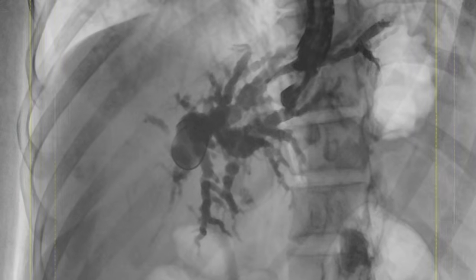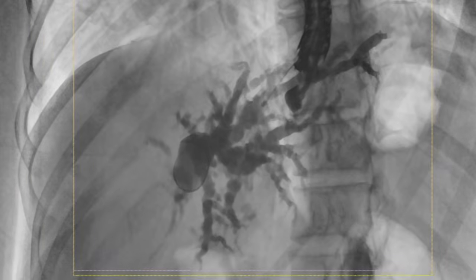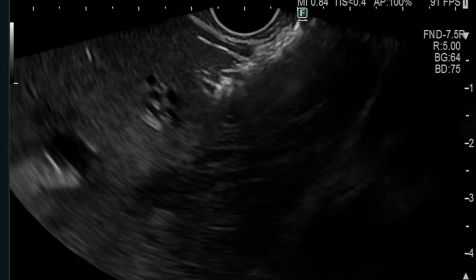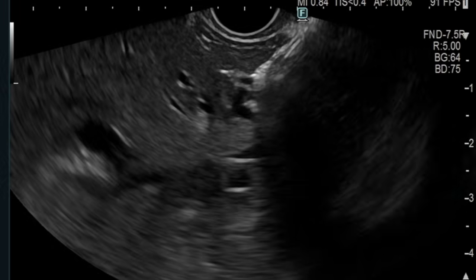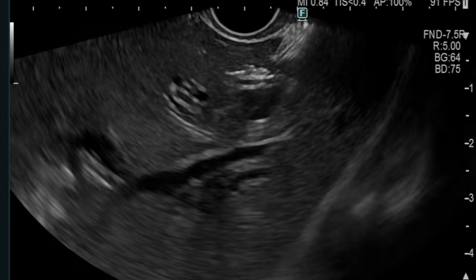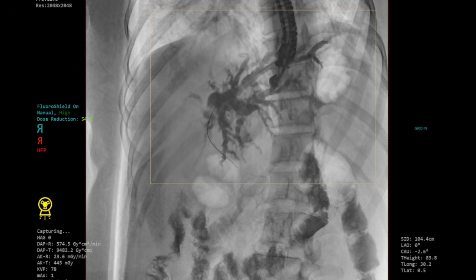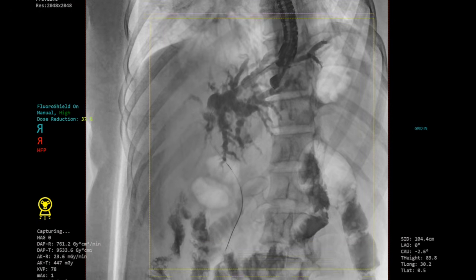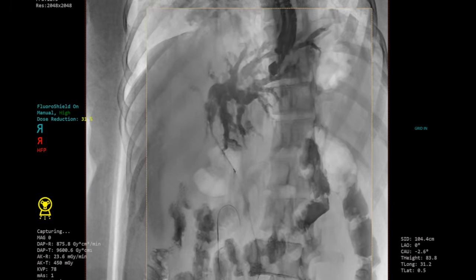Please visualize the seamless cystotome passage from the biopsy port and into the intrahepatic duct on sonographic view and on fluoroscopy. If there is resistance, bring the guide wire in view at EUS and reattempt the puncture. Once the cystotome or catheter is advanced to the liver hilum, a straight guide wire can be used, if required, to traverse the stricture and into the duodenum. This requires extremely fine torquing.